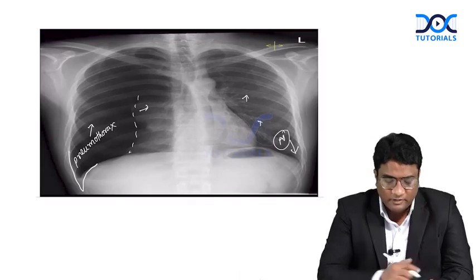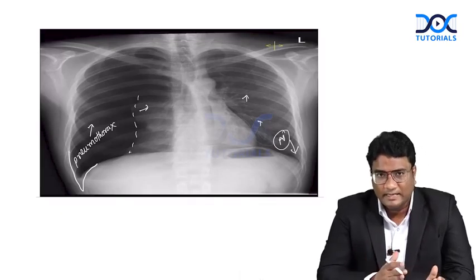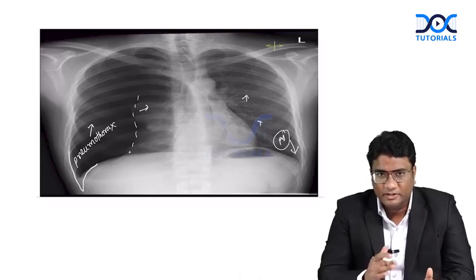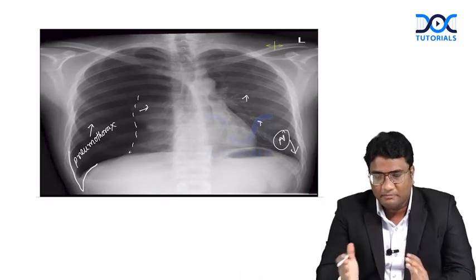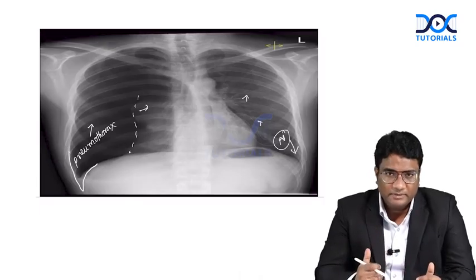On a chest radiograph, when you compare the lung fields bilaterally and symmetrically, you see a more lucent area which is not having any bronchovascular marking. You'll also see a visceral pleural reflection and a deep sulcus sign. Deep sulcus appearance: compare both costophrenic sulci, the side of pneumothorax will have a deeper sulcus.